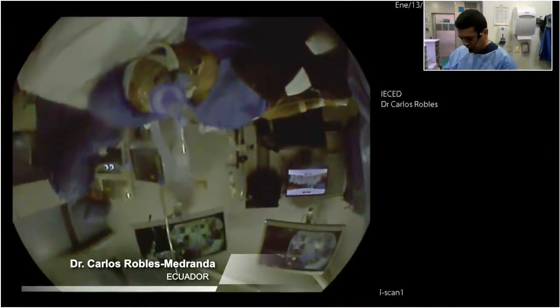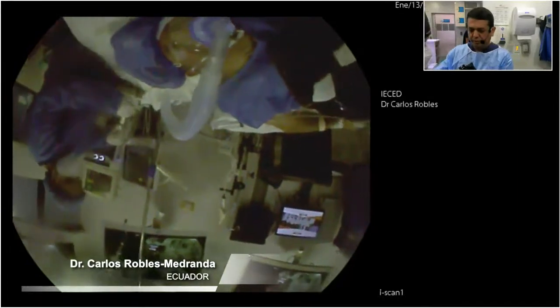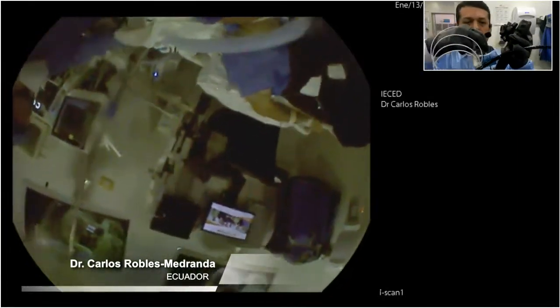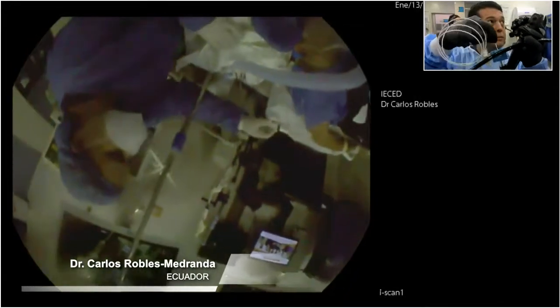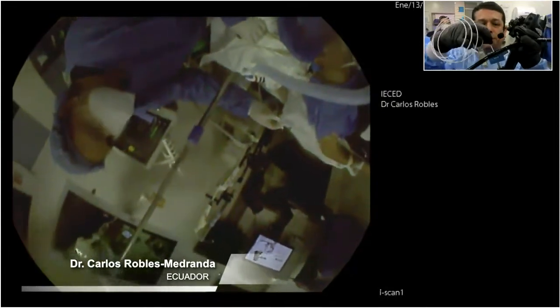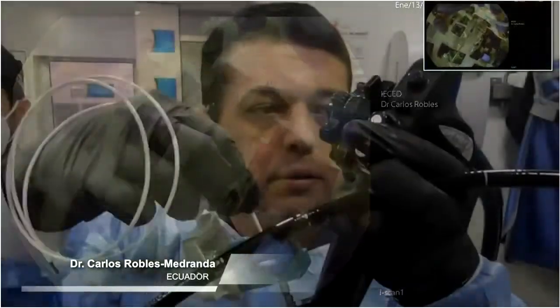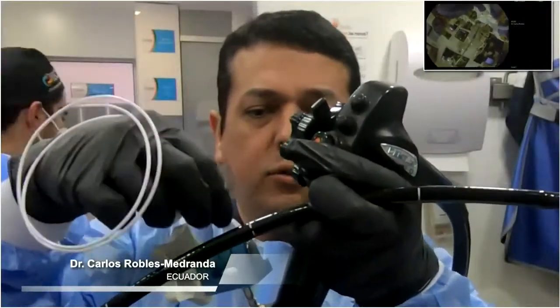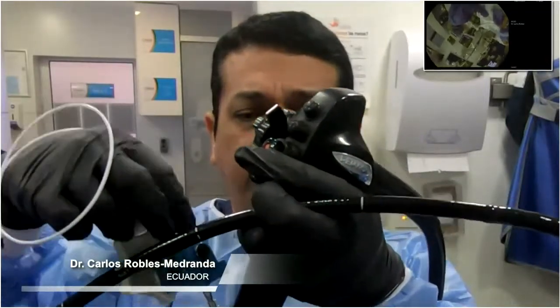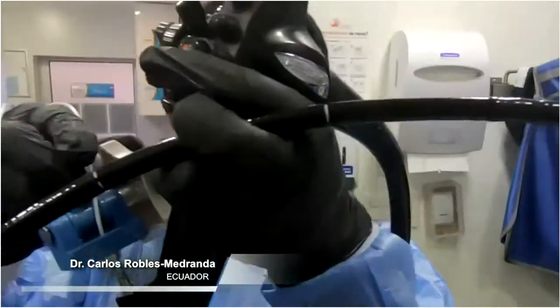So now I have my technician here. So you can see here. I want to show you. You need to pass a catheter to recover the other part of the band ligation here. You see here.